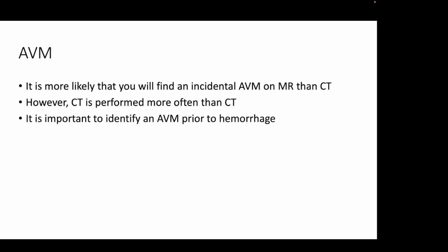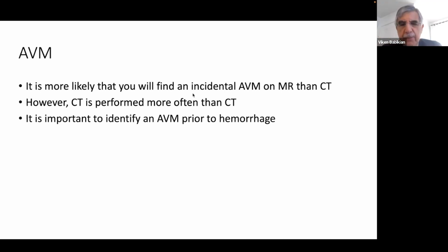So no need to do thin slices. No, I don't think for diffusion that you need thin sections in the posterior circulation. Okay, thank you very much. But I think you'll have better signal, and the image quality will be better too. Okay, thank you.